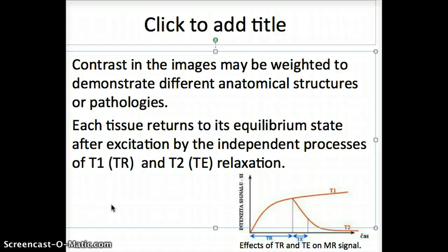This image weighting is useful for assessing the cerebral cortex, identifying fatty tissue, characterizing focal liver lesions, and for post-contrast imaging. To create a T2 weighted image, we wait for different amounts of magnetization to decay before measuring the MR signal, created by changing the echo time, TE.